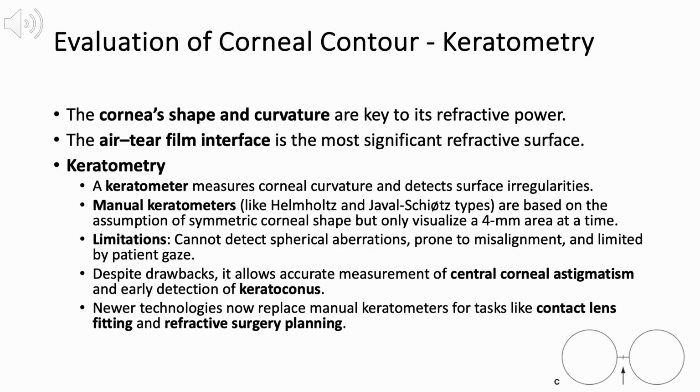The shape and curvature of the cornea are fundamental to its refractive power, with the air-tear film interface serving as the eye's most significant refractive surface. Keratometry is used to measure corneal curvature and detect surface irregularities.